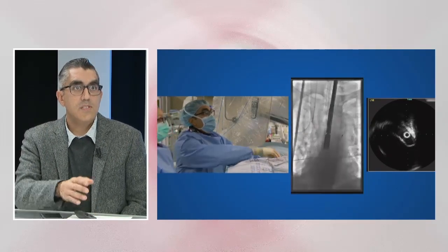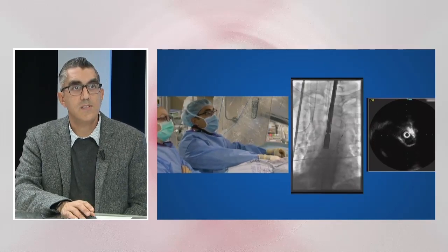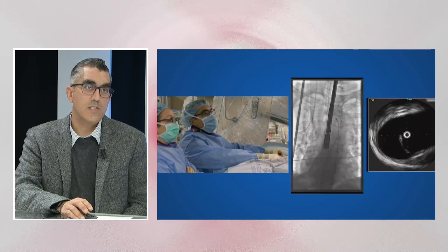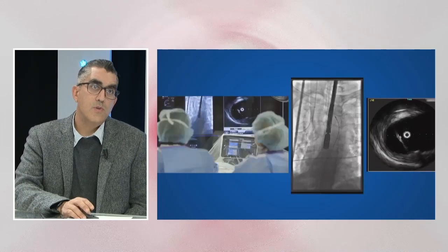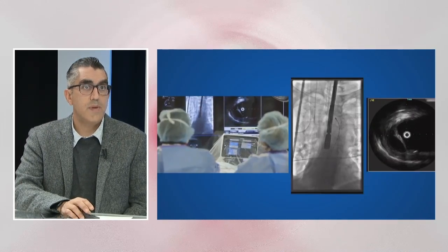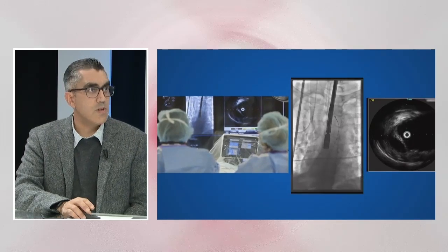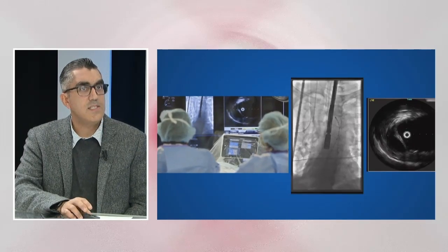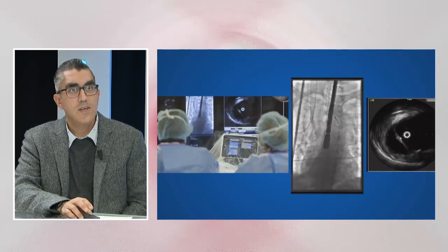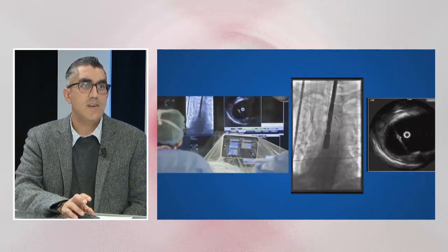You can see here we're in the true lumen — that wire actually made it into the subclavian, so I'm quite happy about that as we're crossing. We do use transesophageal echo a lot: first for wire placement, and second to make sure we're not damaging the ascending aorta or causing a retrograde dissection.